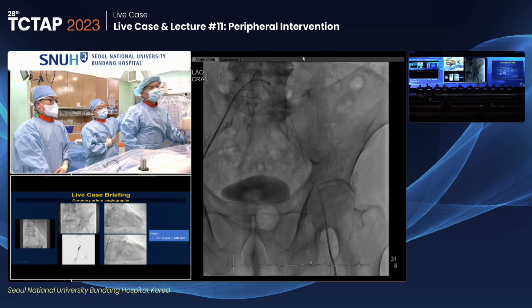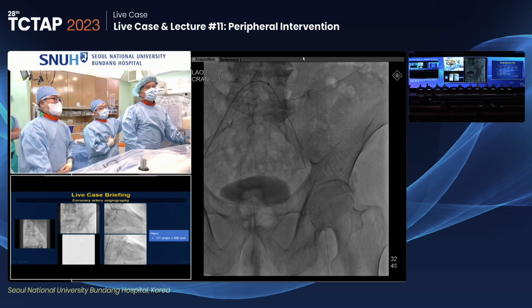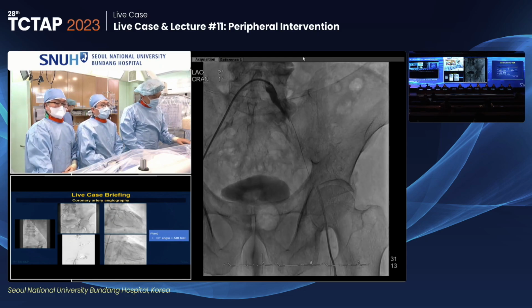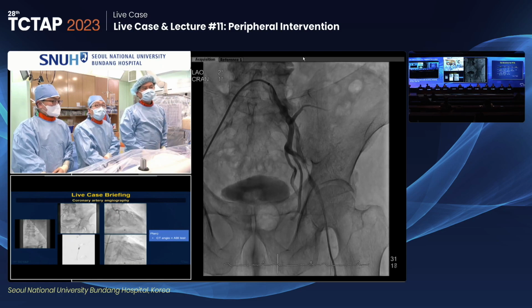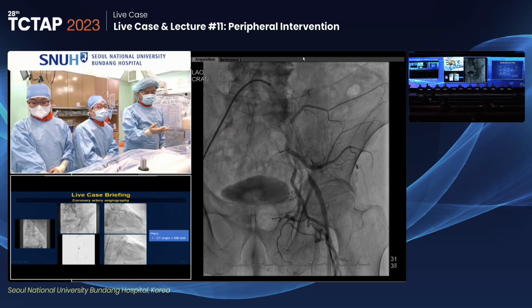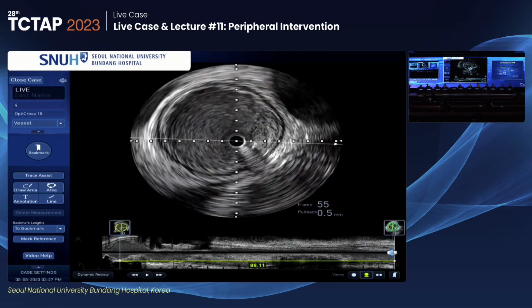Next. This is immediately after pre-dilation, because the procedure was finished too early before coming to here. You were coming to here, so we were very bored. So I did the IVUS while waiting here. So please show the IVUS. IVUS is charged for you, not the patient. Because there is no insurance for a routine procedure, I don't do IVUS, but we have 18 post IVUS system here.